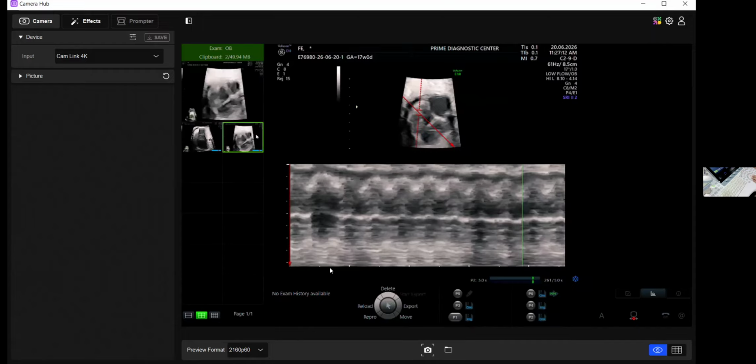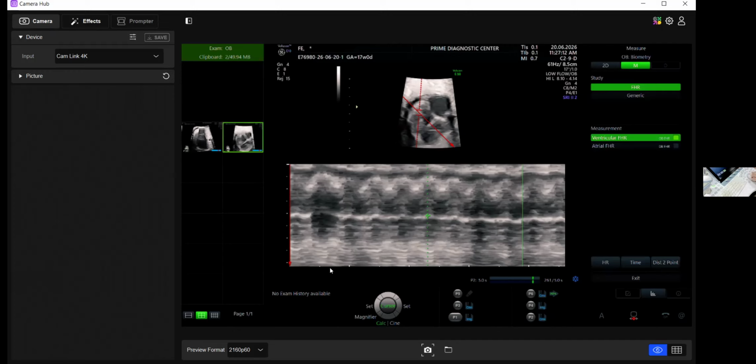See, you see this line is cutting like this. Whichever is anterior, this is the pericardial fluid. The very first thing you see here, where this line is cutting, this is the solid one, and this is the pericardial fluid. You can take a measurement of pericardial fluid here. Where do you take it? You take it in systole. Okay, so I take a measurement here in systole. This is systole, this is diastole, this is contraction. So I take a measurement here again during the systole, and see it's just about 2 millimeter, which is fine.